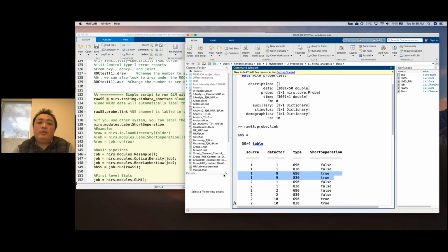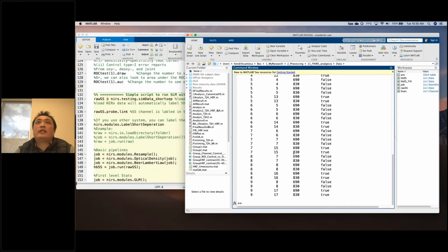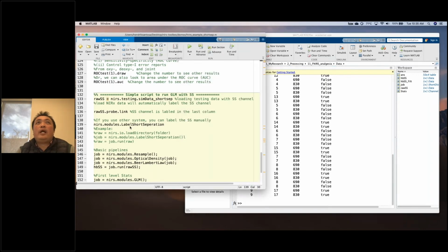The good thing is if you use a NIRx system, it will automatically label this if you have short separations. But what happens if you don't have a NIRx system? For example, you use a Techen system or another system. We have these modules to label short separations.